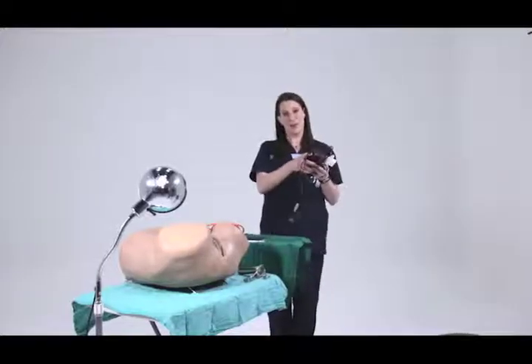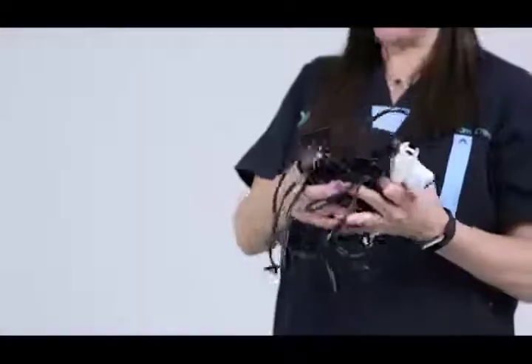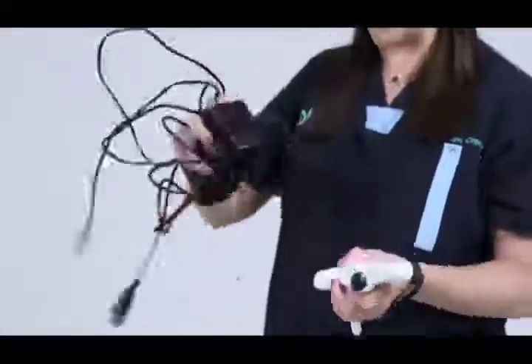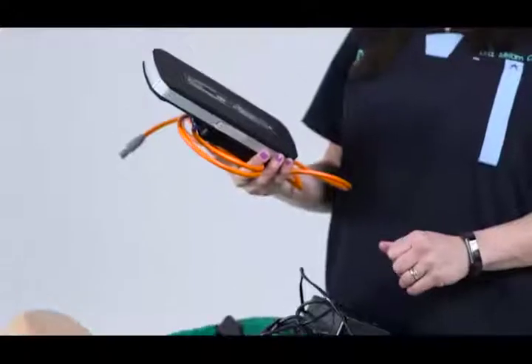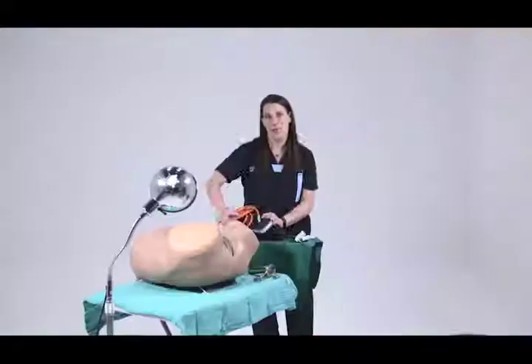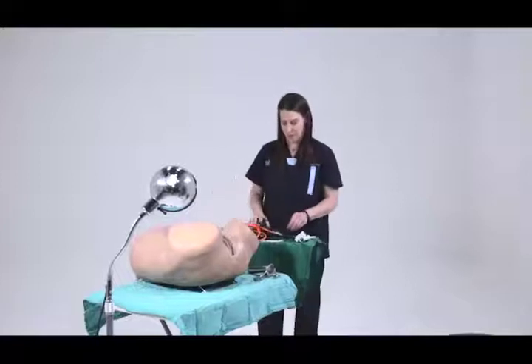This is all of the equipment that you need if you have electricity to do treatment for cervical pre-cancer. You also have the alternative to use an external battery pack as a power source and I'll show you how to connect both and give you recommendations for use.